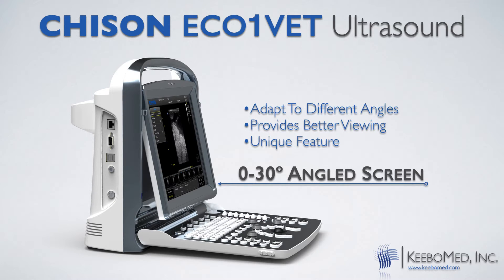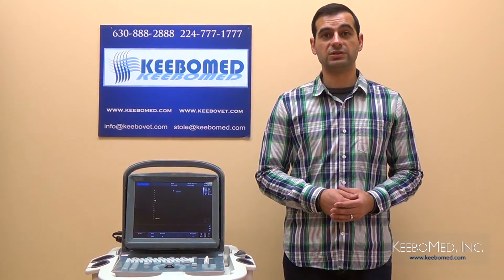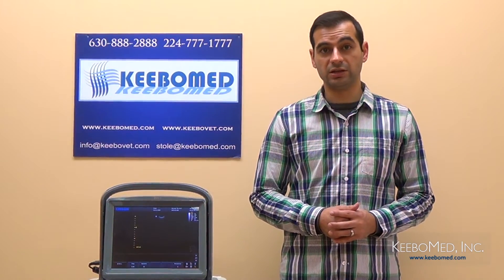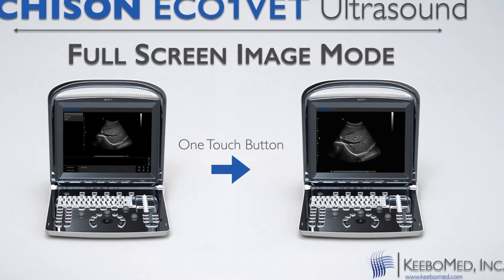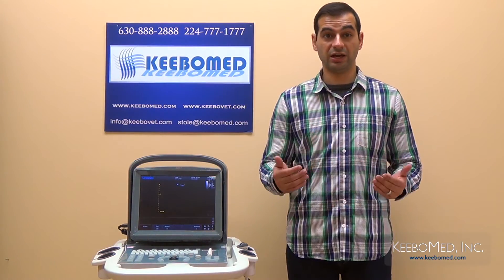To go along with the larger screen, the EcoOne Vet also produces excellent image quality. It has a 256 level grayscale, and it includes advanced image capabilities. Some of these include compound imaging, SRA, and iImage, which is a special image optimization software. And one of the most unique features of the EcoOne Vet is the full screen image mode. With just one touch of a button, any image that is on the screen can be viewed in the entire screen. This allows for more confidence in making a diagnosis because details can be seen easier. Most veterinary ultrasounds on the market today do not have this important function.